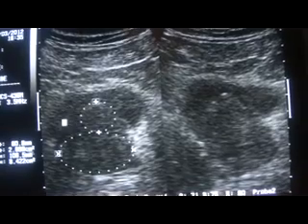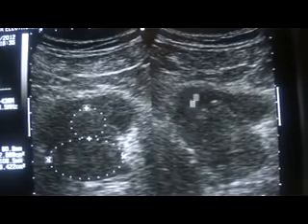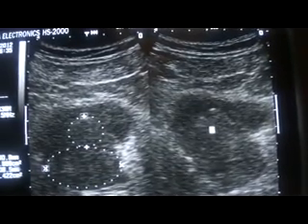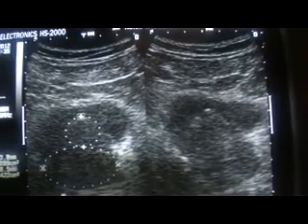In longitudinal section, you will see a better view in this section. You will see that this is the median lobe, this is the prostate, and this is the urinary bladder. This is the urinary bladder in transverse section. This is the calculus. This is the sharp posterior shadow from the calcoli.